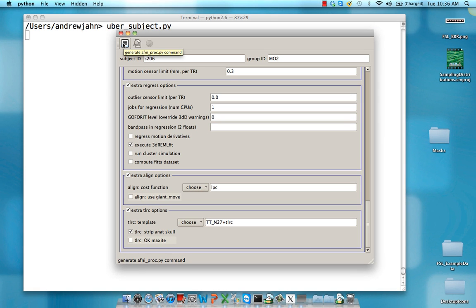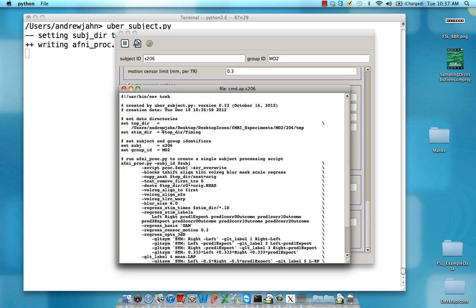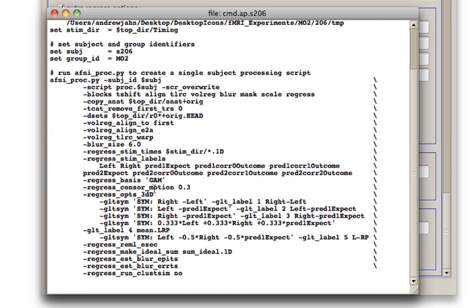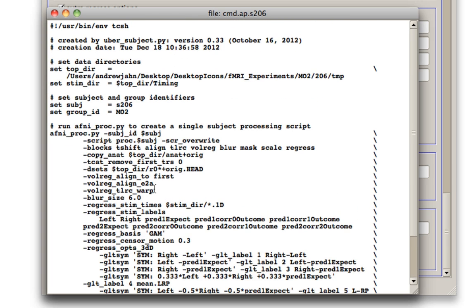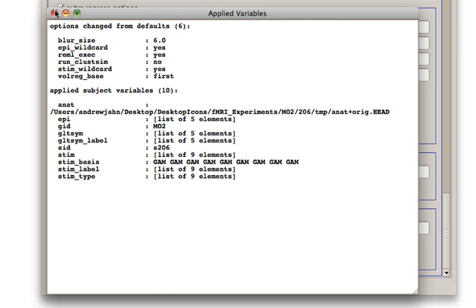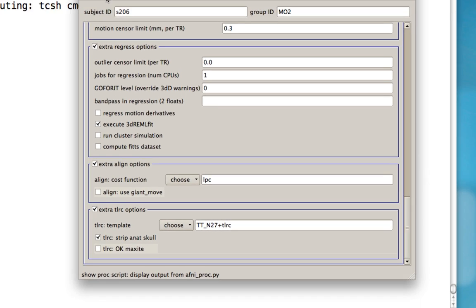Once you're done with all that, click on this generate AFNI proc.py command. So in a sense, uber_subject serves as a wrapper for AFNI proc.py. You'll see this example command, which we'll use to generate a script for your subject. Once you're happy with that, close that out. See any defaults that you've changed and make sure that everything looks okay to you.